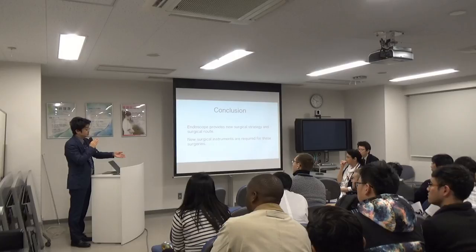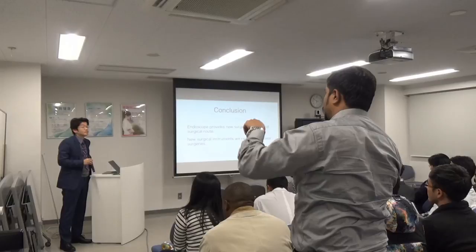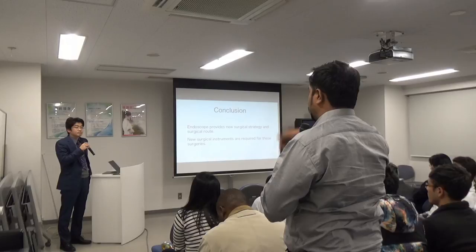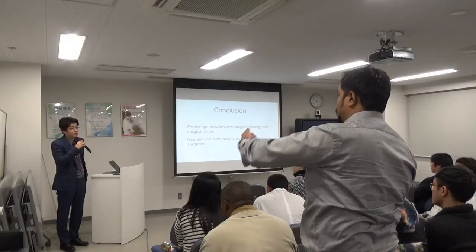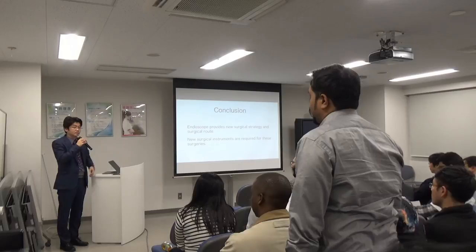Thank you. I just would like to ask, how did you come to know that you have reached the tumor? Did you use any navigation? Of course, I use a navigation system. Navigation. Yeah. Second question: you showed one brainstem cavernoma, and you have gone supratentorially. So did you open the tent and then go? Yeah, I cut the tentorium, also through the endoscope, through the same. Oh, okay. Do you have any special navigation to find it? The same. You use the same. Okay. But I registered the endoscope tip as a pointer. Pointer. Oh, yeah. Okay. That's what I wanted. Thank you.